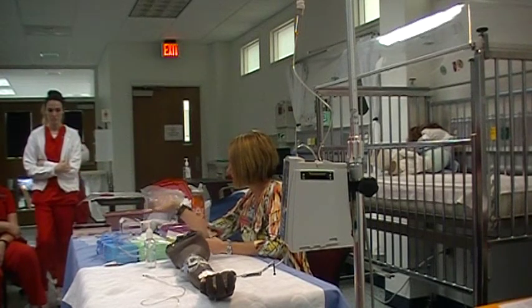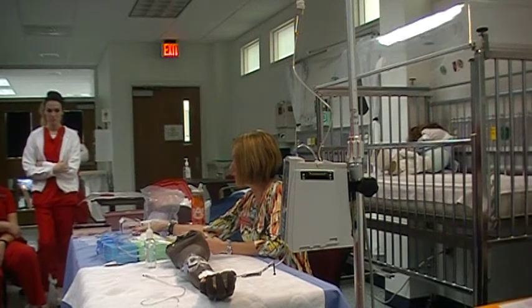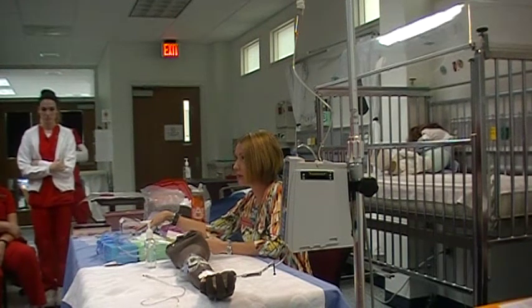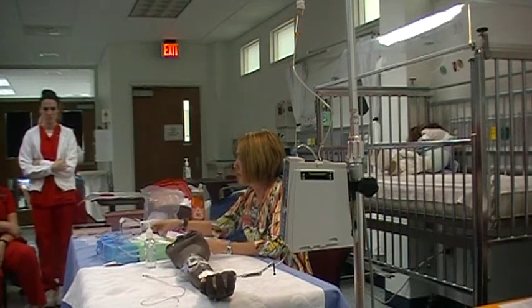So you will prepare the medication correctly, by cleaning it, drawing up the right amount. You're going to do your dosage calculation here. You're going to make sure that it's right. Solu-Medrol. I have 2 different Solu-Medrols on the table for you.